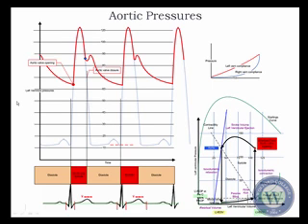The pressure waveform that generates the aortic pressures is generated by the left ventricle. Now, the left ventricle, at the minimum, has to reach that pressure or exceed it. In some kinds of valvular diseases, you will actually see that the intracavitary left ventricular pressure is higher than your aortic pressure that's generated, simply because of the resistance due to the valve.